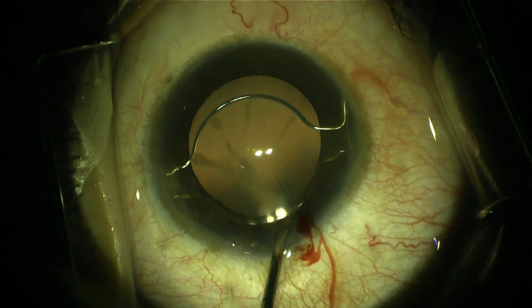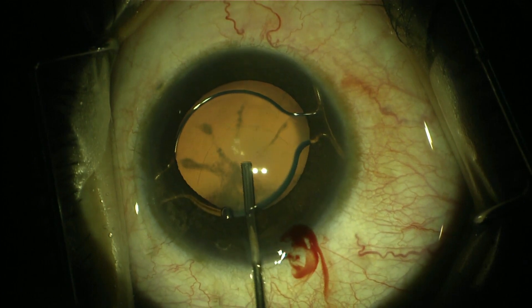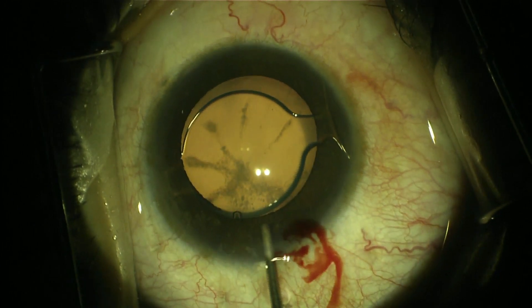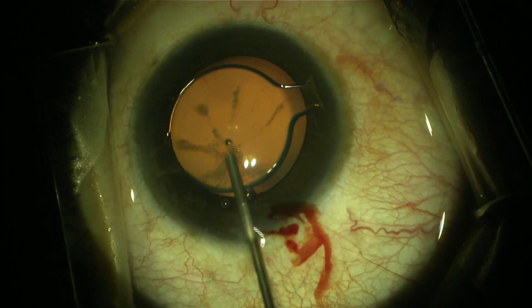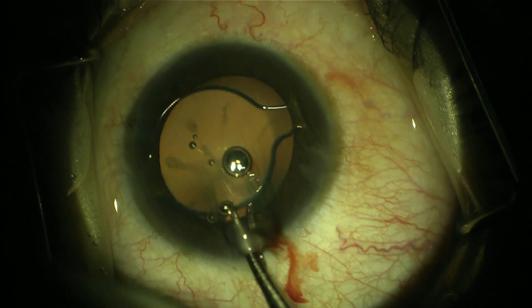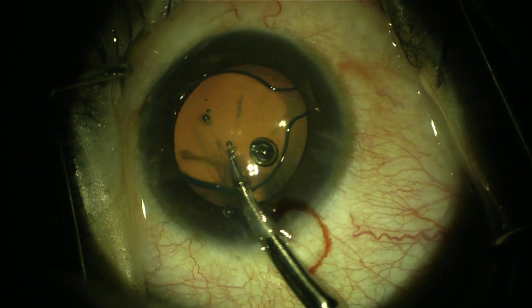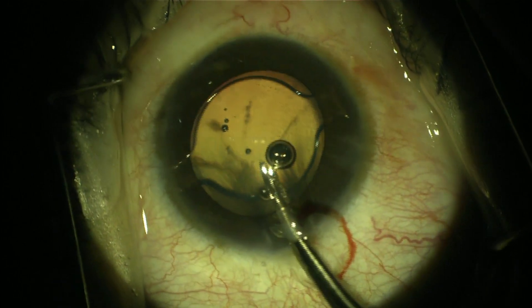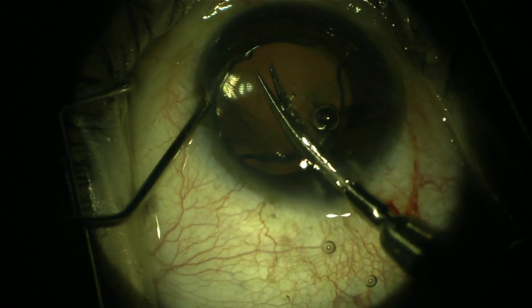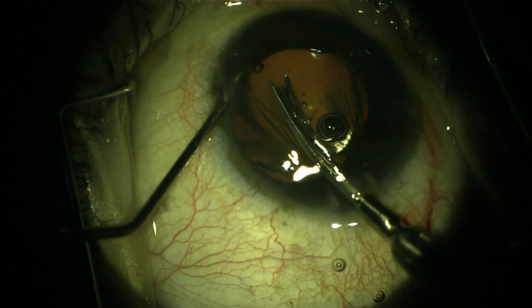I decided to remove the anterior chamber phakic IOL and then perform phacoemulsification. As the phakic IOL is a foldable lens, it was easy to cut it into two or three pieces.